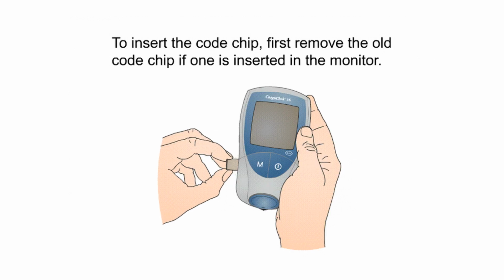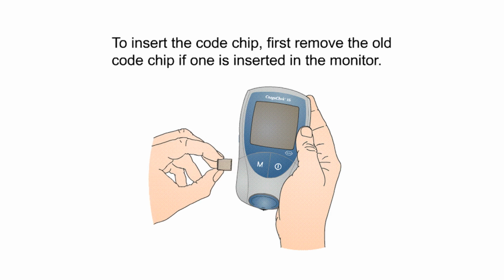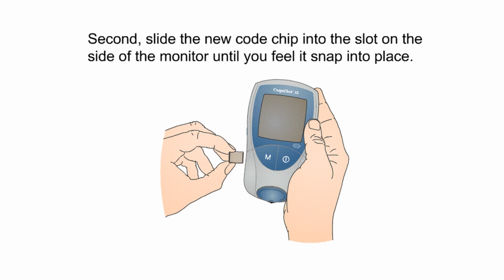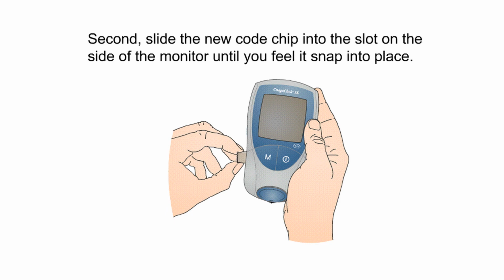To insert the code chip, first remove the old code chip if one is inserted in the monitor. Always make sure that the number on the code chip matches the number on the label of the test strip container. Using the wrong code chip can produce the wrong results, which could be life-threatening. Second, slide the new code chip into the slot on the side of the monitor until you feel it snap into place.